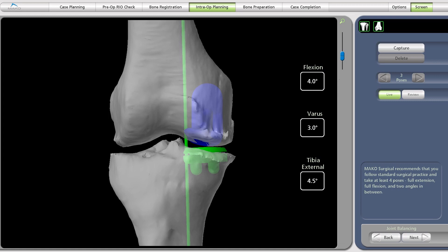Once we've finished preparation of the bone, we will then place our trials and re-evaluate our correction. In this patient, the implants are extremely well-fitting. We've also corrected the flexion from 6.5 to 4 degrees, which is essentially neutral. We've corrected the varus deformity 2 degrees from 5 down to 3. And you can see we've restored the mechanical axis back to its proper position. Now that we've confirmed this, we're able to proceed with the final stages of implantation.